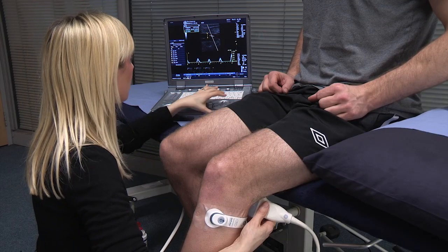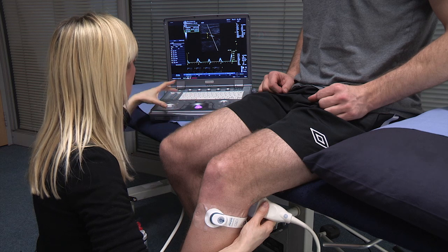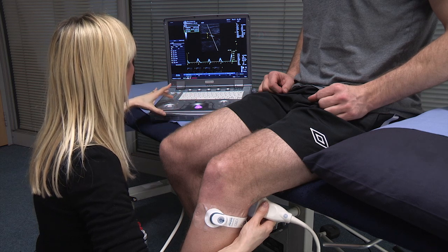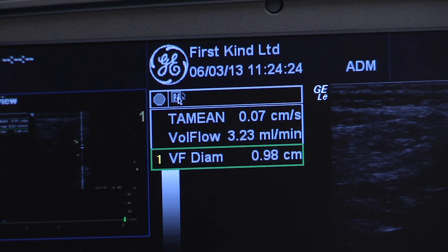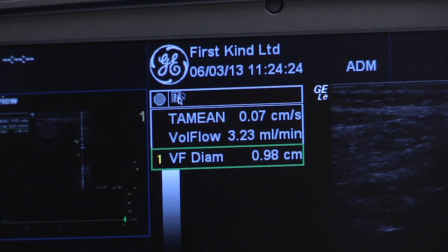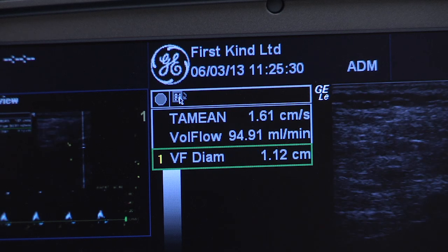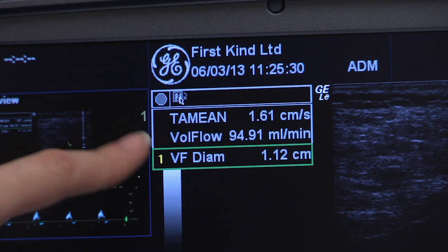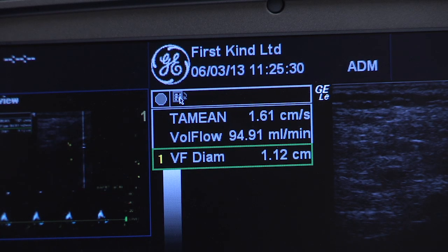That gives us a volume flow of 94.91 mils per minute — so there's been a significant increase. Looking back at the previous one to remind us: at rest, there's a very small amount of flow going back up towards the heart, with a blood volume of 3.23 mils per minute. Then with the gecko on at level three, we have 94.91 mils per minute, and you can see we've got pulsatile flow — it looks very much like an artery.